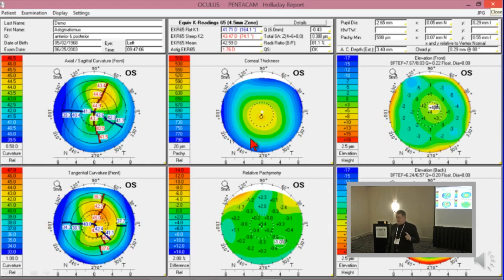And here's what I'm saying. You don't use total power for your IOL calculation because you're going to make a mistake. Right. And I'm saying that the net power and the EKR 65 give you a value that's almost the same for the astigmatism, okay? Because that 1 diopter difference is reducing it by 1/45th, so it doesn't change the astigmatism much.